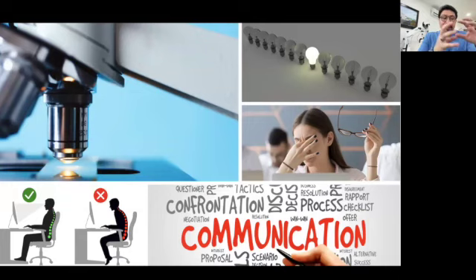And this possibility of getting digital material related to your procedures, it's an advantage that can be applied to the advertisement of your clinical practice or your office, because you can get pictures and videos in real time, and you are not going to need to stop or to interfere with your clinical protocol and with your clinical workflow. You just continue working, and the dental assistant can start taking pictures when you require it.